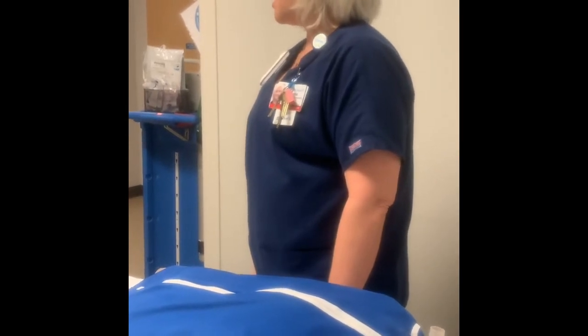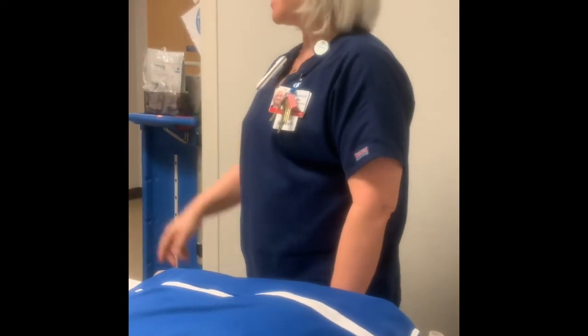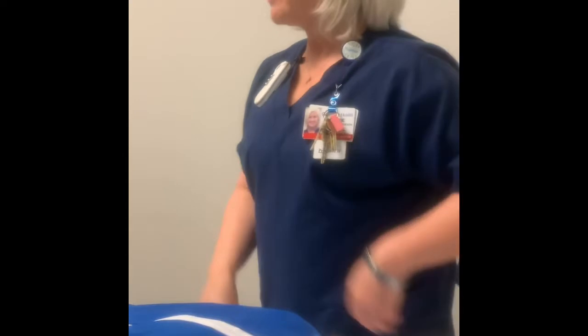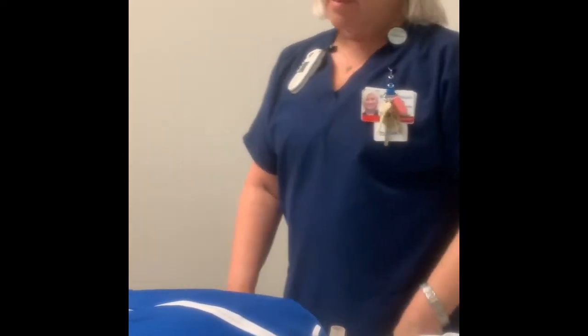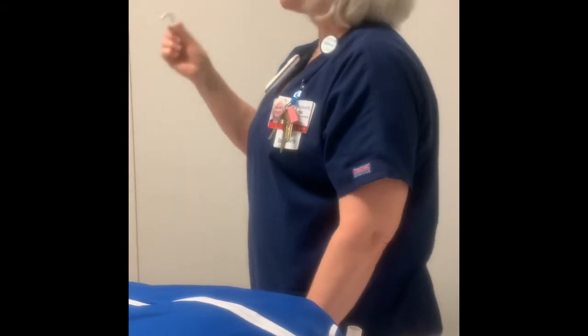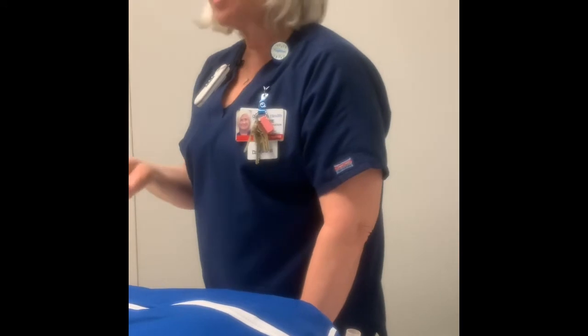Sometimes I'll call Schellenberger's clinic, Dr. Schellenberger or Tomei, to come and put your trach back in. But you're welcome to reach out to me. I'll pop over and put it back in for you. But remember, what do I have to have at the bedside though? My obturator. I have to have an obturator, because if the physician comes over, the first thing they're going to ask for is an obturator.